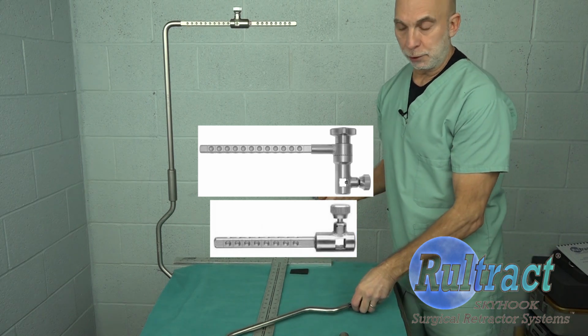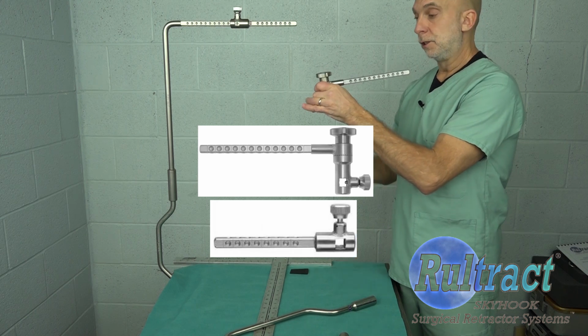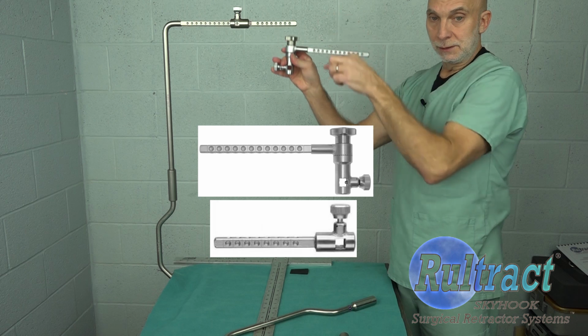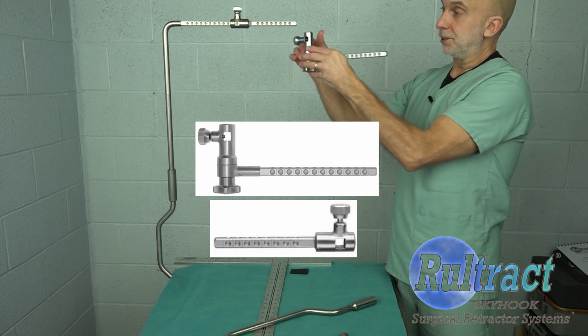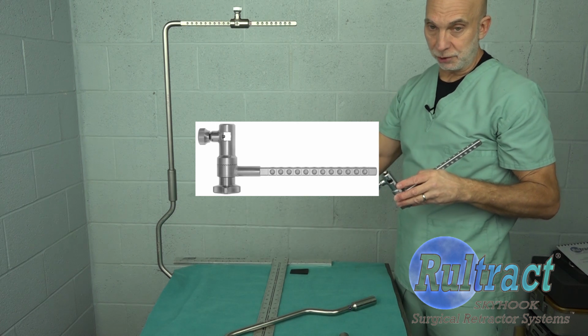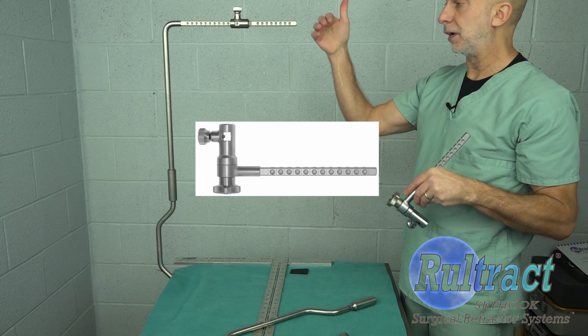Next, you're going to take your rotating extender bar. Now, if you have a large patient, you're going to want to put this on with the knob on the top. If you have an average size patient, you'll want to put it on with the knob on the bottom. Reason being, if it has the knob on the bottom, you're about 2 inches closer to the patient. Obviously, with it on the top, it gives you an additional 2 inches of height.